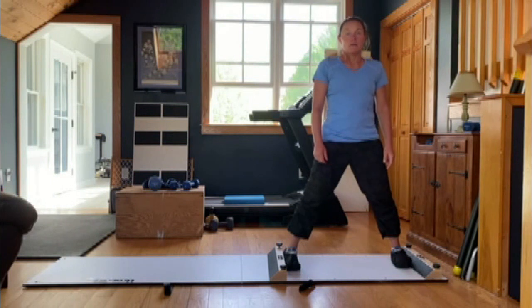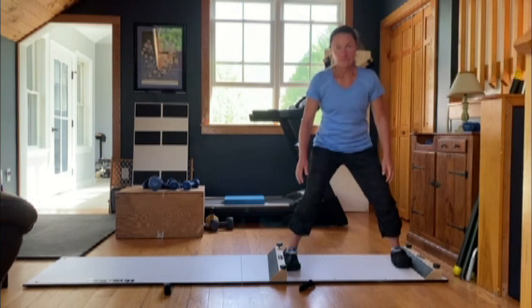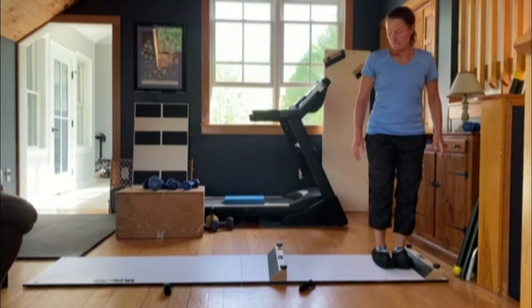So you can do that with the other block too, but just to give you an idea of the first exercise that's recommended, it's something we call a slide and glide. It gives you the ability to start on one block, slide a foot across, make contact before you draw the other leg across and bring your feet together.